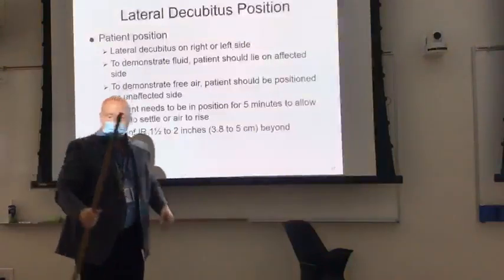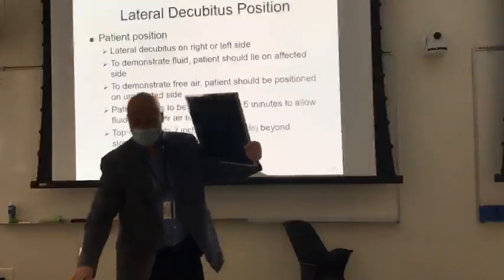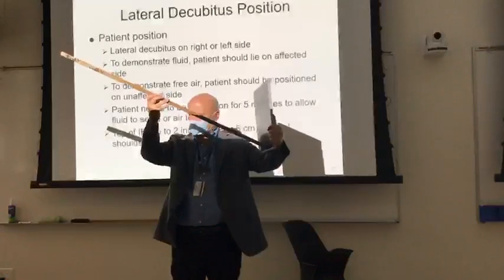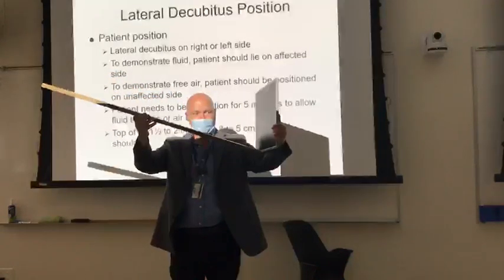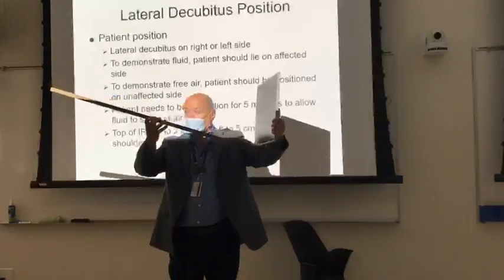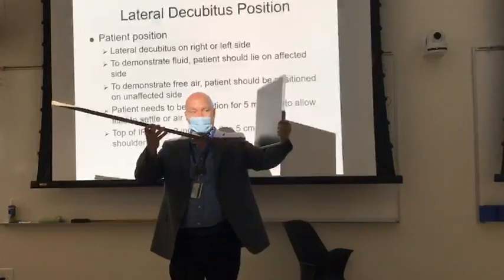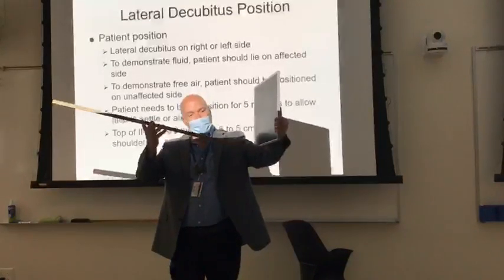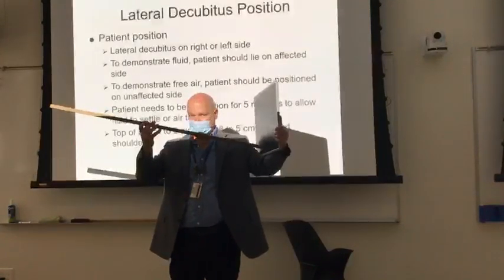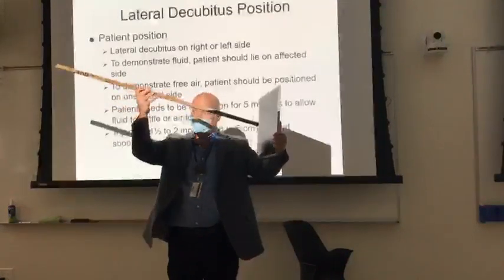Okay. All right, so on a decubitus chest x-ray, if the bottom of the patient is right here at the bottom of the image receptor, and my central ray is pointing a little bit down like that, what's going to happen to the anatomy? Is it going to be on the image receptor? It's going to hit the anatomy right here, and it's going to project it off of the image receptor, right? So how could you avoid that from happening? Two ways. One is drop the image receptor down, but if it's already on tabletop, can you do that? No, so what might you have to do? Elevate the patient up, right?